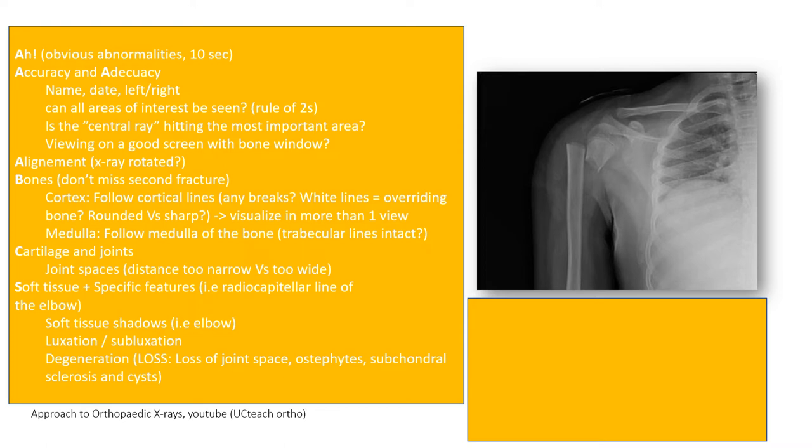So now we go through all the bones. Let's go through the humerus, and I can't zoom in here, sorry, but that would be the best thing to do. We're going through, and it seems like, yeah, that's obvious. And then you have here, and it doesn't really. So you just go along the lines of all of these.